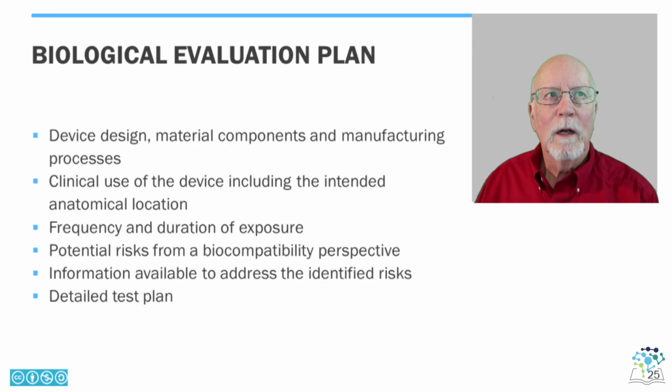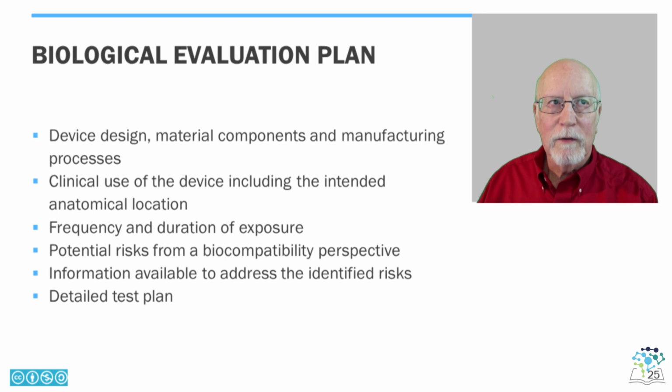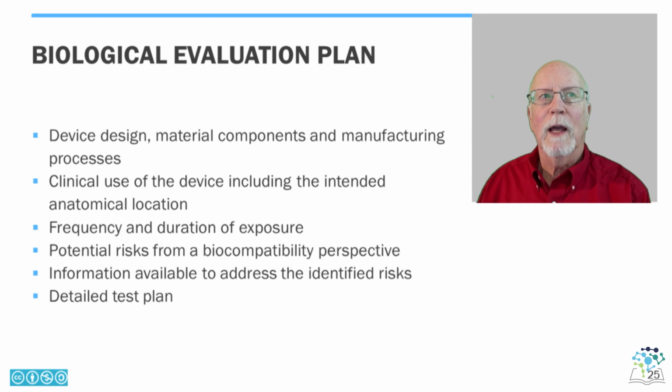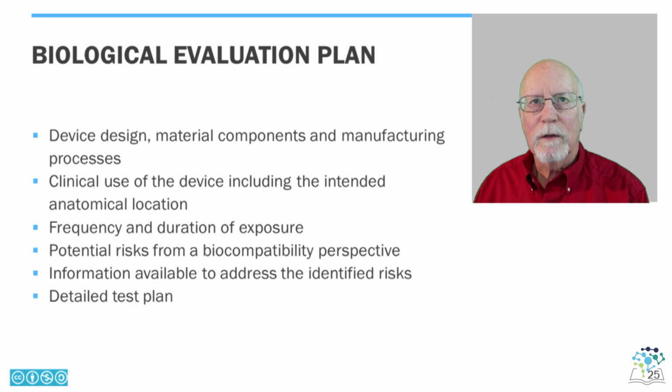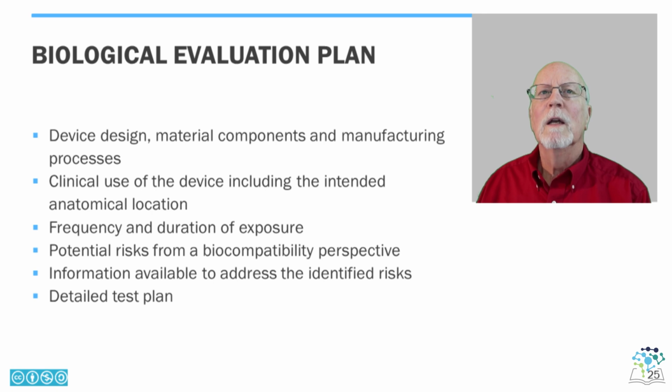What we just did are the first steps in constructing a BEP. You can do it yourself. However, you may also ask your friendly contract lab for some help. It's sometimes free when you agree to perform the testing with that lab, or if it requires extensive planning and complex risk assessment, it can be obtained at a nominal cost. Overall, it's a guide for the next stages of meeting these compatibility standards.